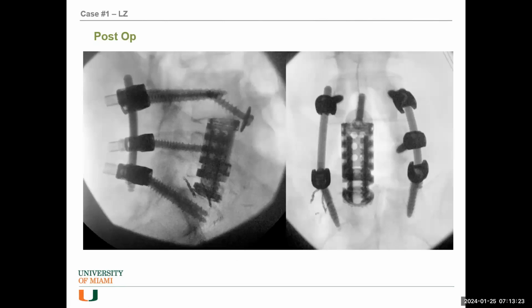This was the post-operative imaging. So very, very nice decompression. You can see the corpectomy cage, essentially that right side with a transpedicular decompression. You can see, obviously, the pedicle there is completely gone. Screws, great alignment. So this was the final result after that intervention. And the most recent MRI suggests that there was no recurrent lesion. Everything was taken. The guy's intact, doing very well.